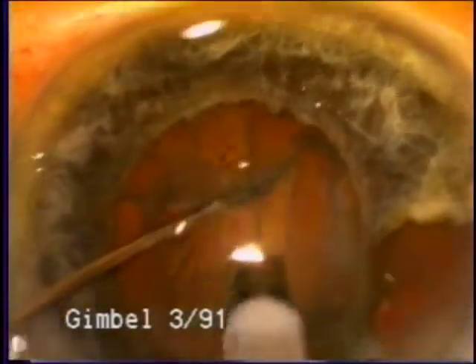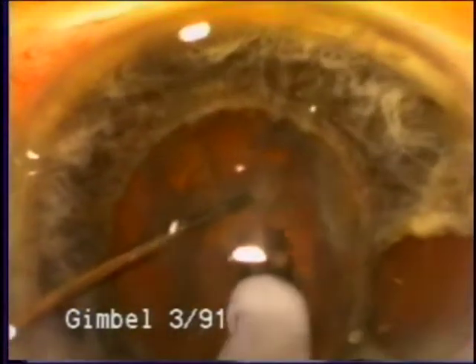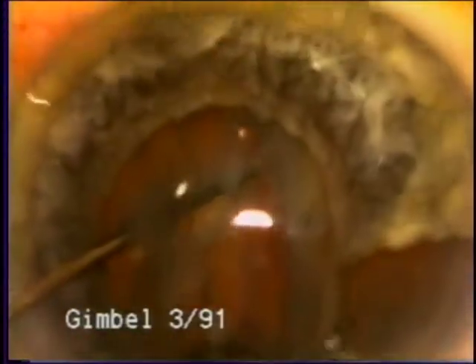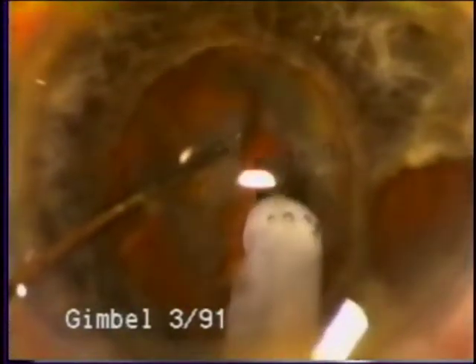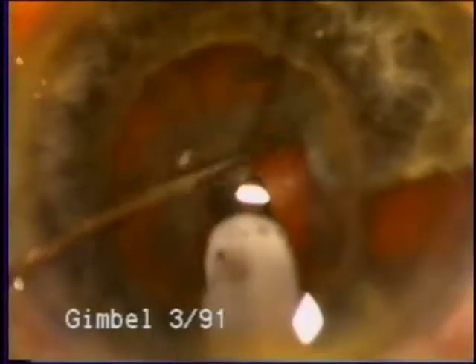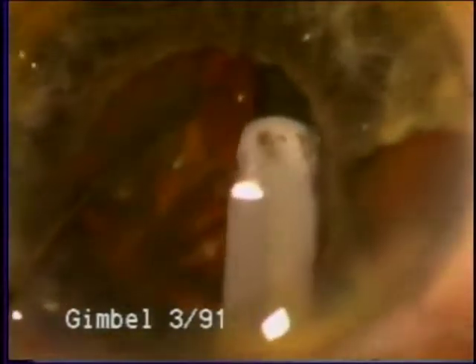This phacoemulsification in this case that we observed earlier for the sphincterotomies shows one of the earliest applications of the downslope sculpting technique with the lens nudged inferiorly, and most of the sculpting in the center of the lens. This technique was developed in the small pupil cases because of the limitation of the view and because of the desirability of keeping the phaco tip near the center of the lens.